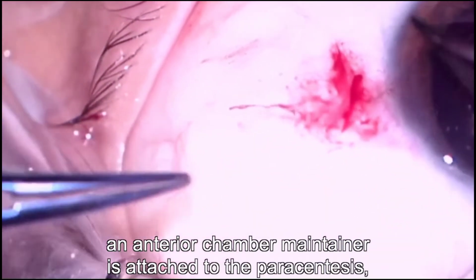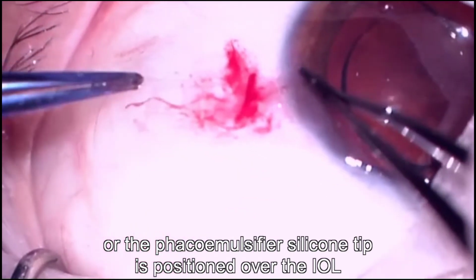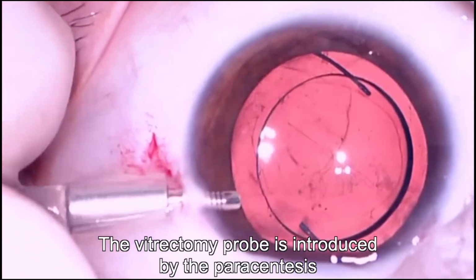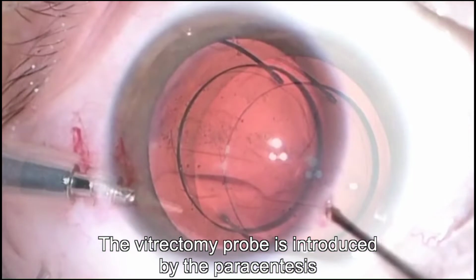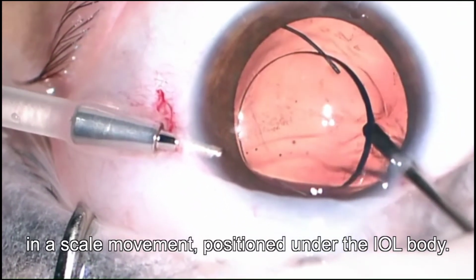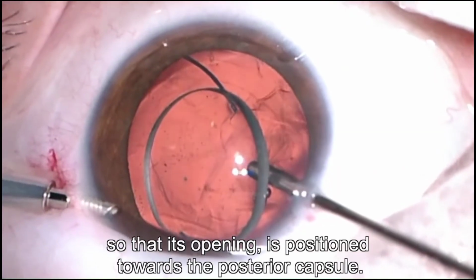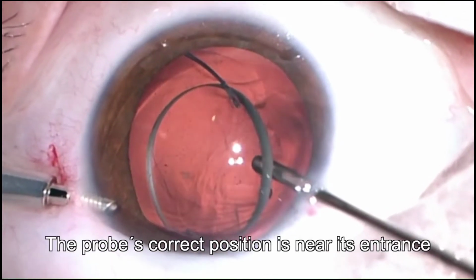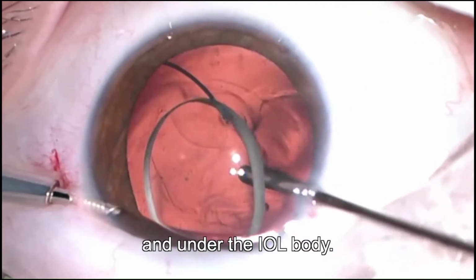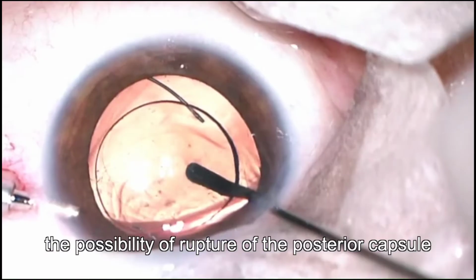After phacoemulsification and intraocular lens implantation in situ, an anterior chamber maintainer is attached to the paracentesis, or the phacoemulsifier silicone tip is positioned over the IOL for continuous irrigation under low positive pressure. The vitrectomy probe is introduced by the paracentesis in a sweeping movement, positioned under the IOL body. The tip of the vitrectomy probe should be turned, so its opening is positioned towards the posterior capsule. The probe's correct position is near its entrance and under the IOL body.